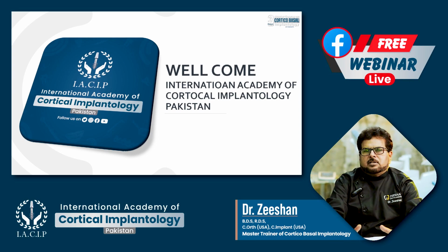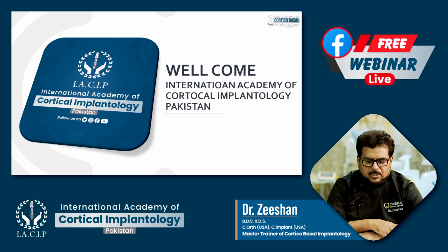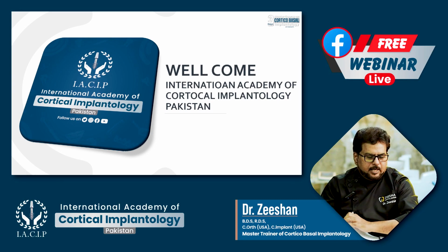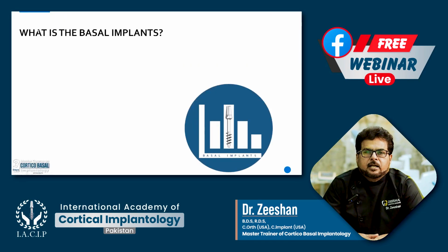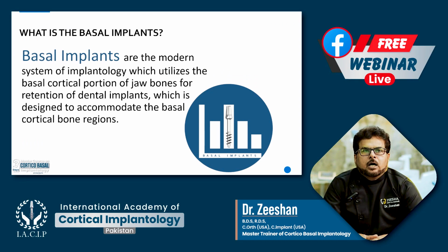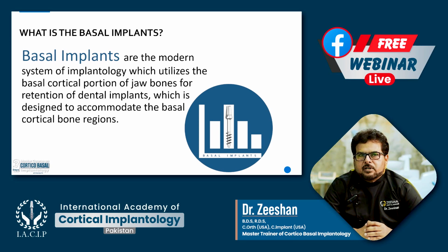As everybody knows, I think now they all are aware about the basal implants, how they provide the strength and primary stability and how they allow us to load them immediately. Basal implant, the modern system of implantology which utilizes the basal cortical portion of jaw bones for retention of dental implant, which is designed to accommodate the basal cortical bone region.